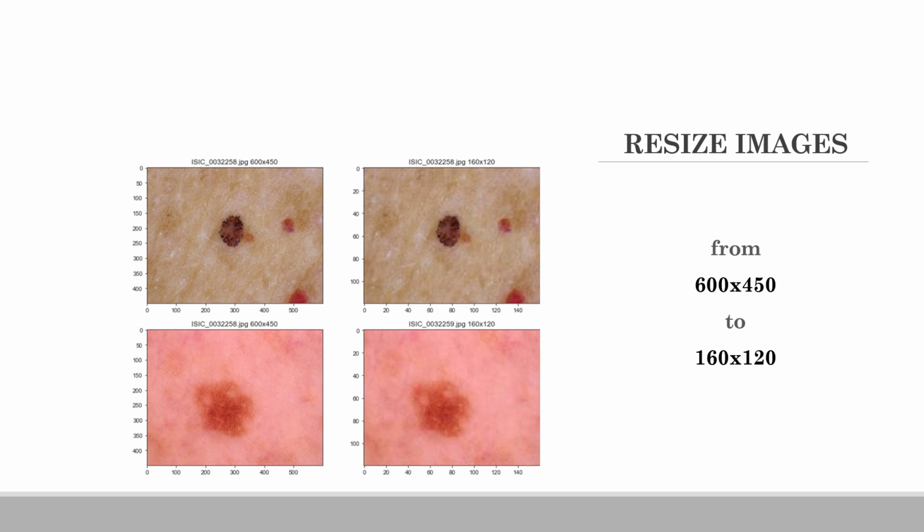The side-by-side image comparison shows some reduction in resolution, but it's really hard to tell. How much of an effect this had on accuracy is undetermined. Probably safe to assume accuracy would improve as the pixel count increases.